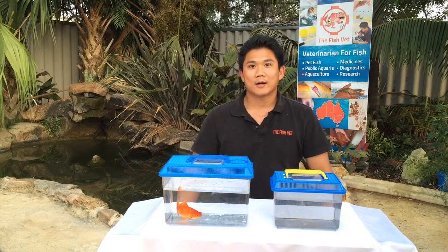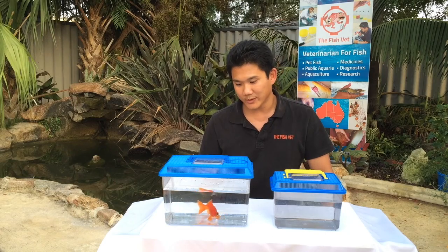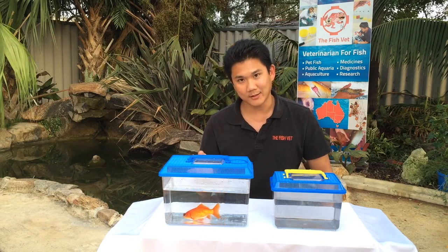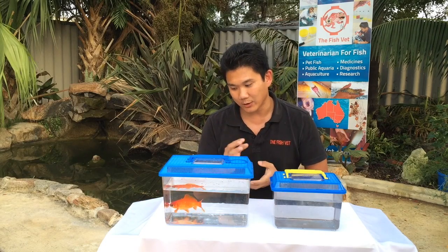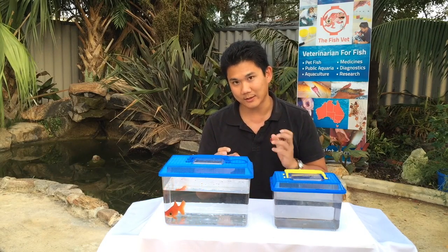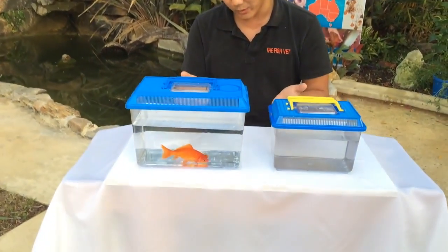Hello, my name is Dr. Richman Lo and I'm the fish vet. Today we've got a comet goldfish, and you can see that one eye is protruding much bigger than the other one. If you have a closer look, you can actually see that the lens of the fish is probably gone and it's likely going to be blind.